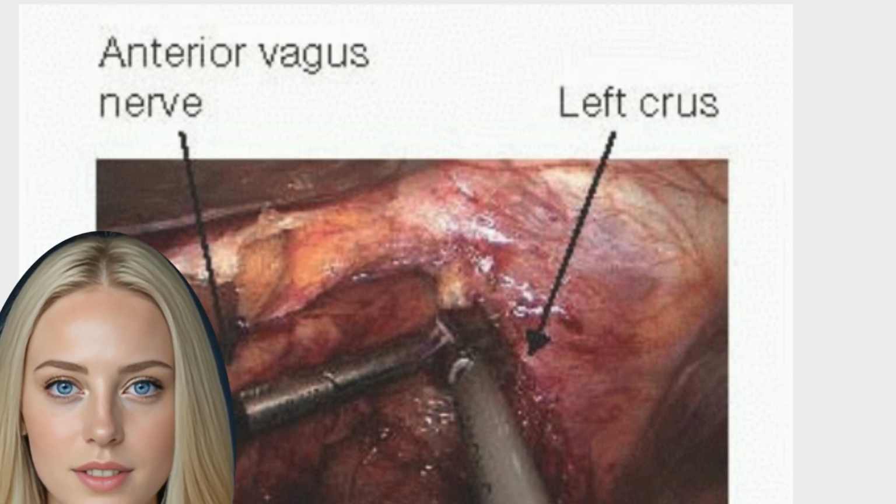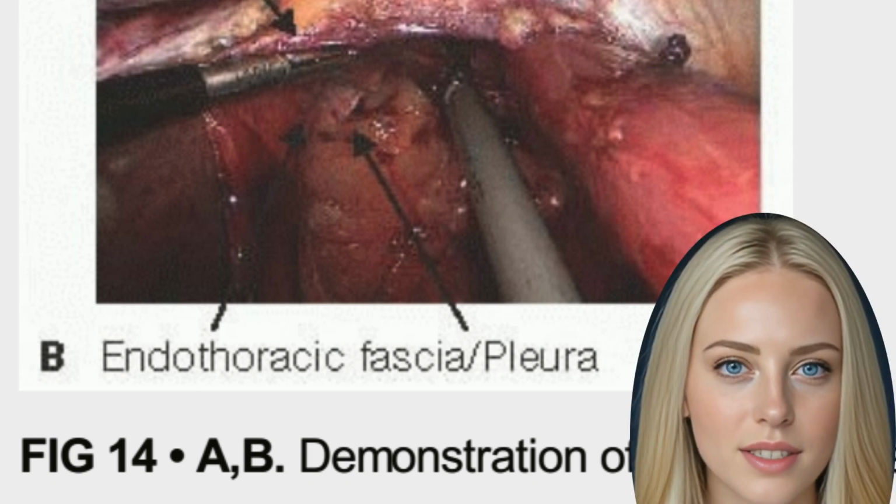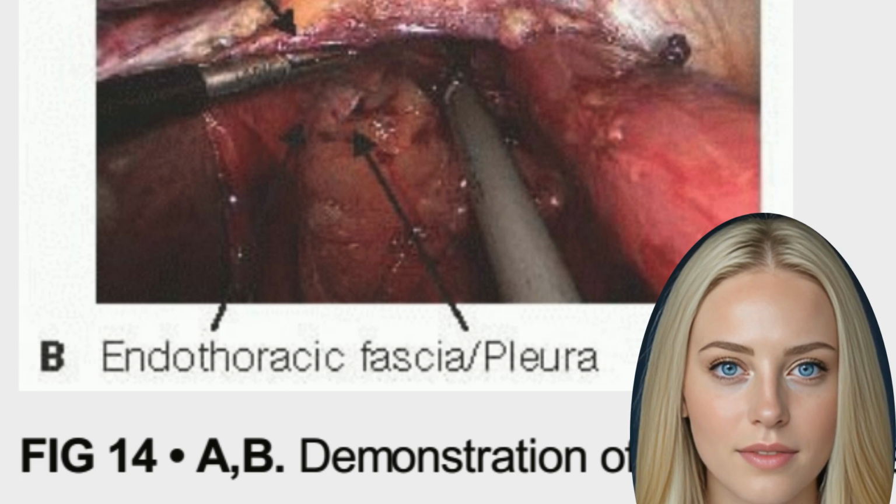The resultant anterior dissection can be seen in Fig 9. Posterior dissection ensues from the original starting point to the right of the esophagus to free the right crus posteriorly and deep, then as much as possible to the left of the GEJ, Fig 8a-b. Dissection from left to right, anteriorly, starting on the left crus.